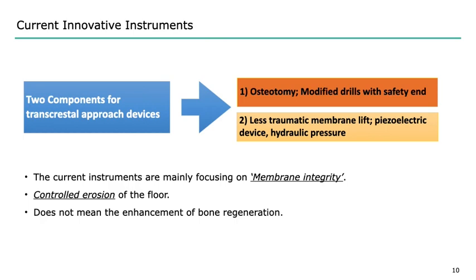Instruments for transcrestal approach have been intensively investigated. People really love that approach. Each device has two components. One is for osteotomy and the other is atraumatic membrane lift. People modify the drills for safety reasons. You can find various types of drills.